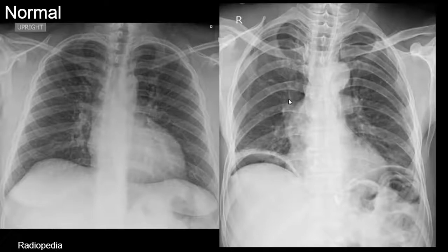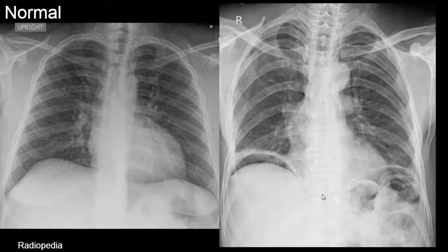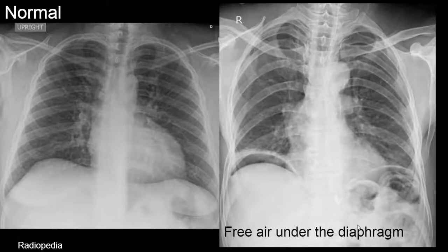Here we have a patient who has an upright chest radiograph. There is an enteric tube that terminates here, so it's probably malpositioned. In addition to that, the more important finding is the lucency under the diaphragm — under both diaphragms — and this is consistent with free air.